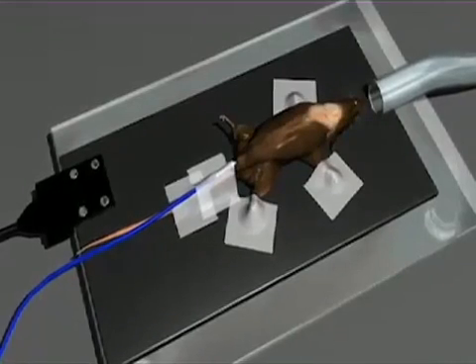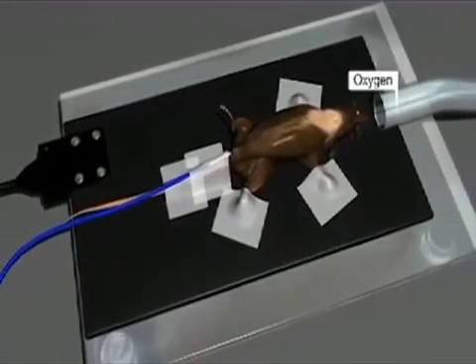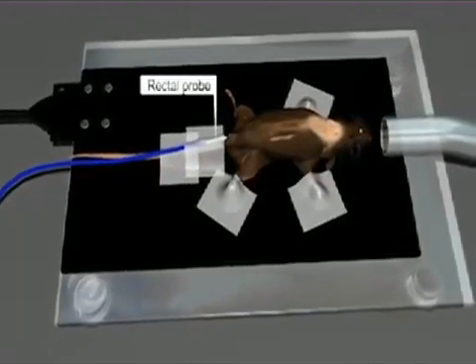The anesthetized mouse is placed on a thermoregulated plate. Oxygen supply is administered through a plastic tube, and body temperature is monitored using a rectal probe.